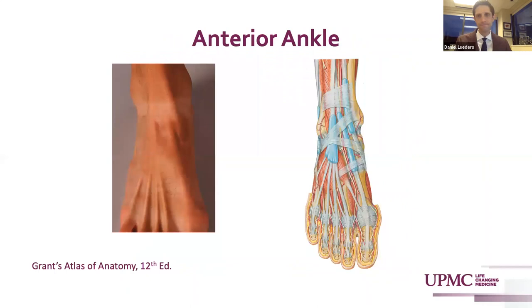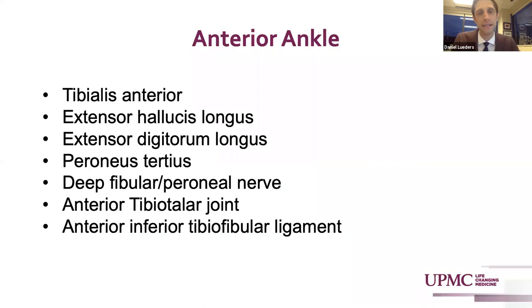The anterior ankle is evaluated with the patient seated or supine and the anterior ankle facing upward. The main muscular, tendinous, ligamentous, and nervous structures in the anterior ankle are the extensor tendons and the tibialis anterior, your deep fibular nerve and superficial peroneal nerve, and then your ligamentous anatomy, your anterior inferior tibial fibular ligament.